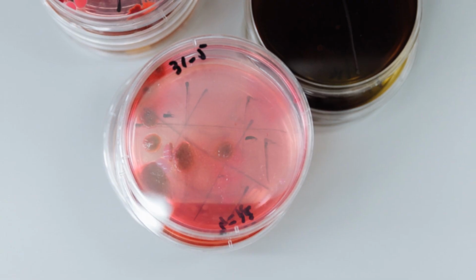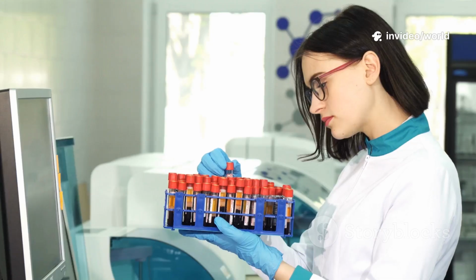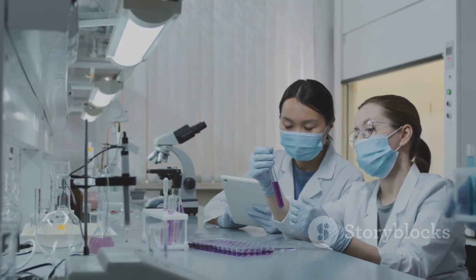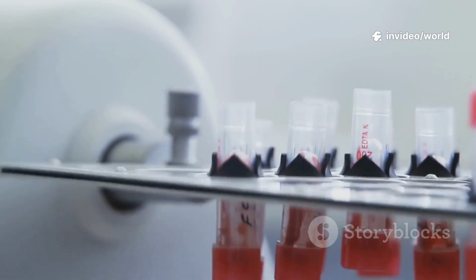If I get a positive culture, that's not the end of the road. I still have to identify what's growing. Molecular tests or biochemical methods come in handy here. And if it's Mycobacterium tuberculosis, I run drug susceptibility testing to figure out if it's resistant or not. That's key for treatment decisions.